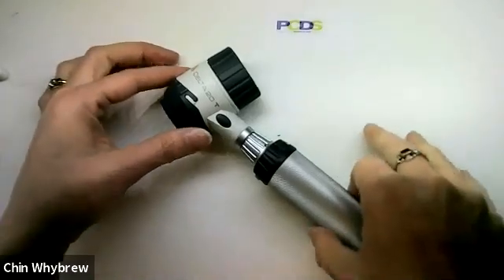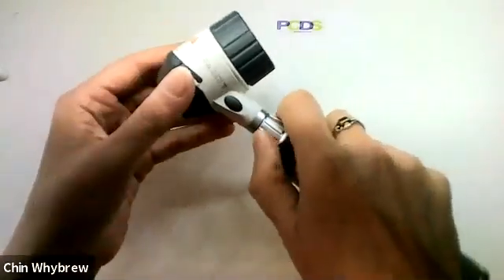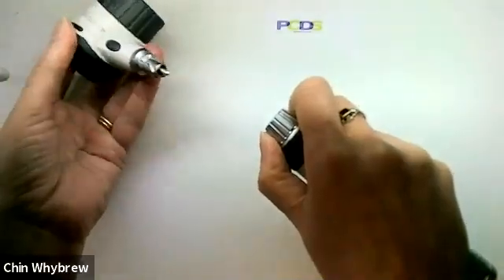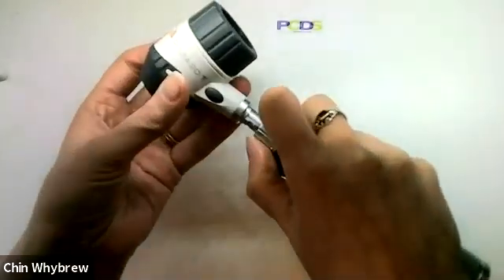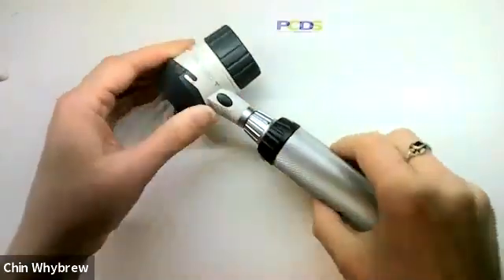The Heine Delta 20T fits onto a standard Heine handle, and if you twist this bit here you can take the top off so you can exchange it for your otoscope or ophthalmoscope. Just pop it back on again and go.